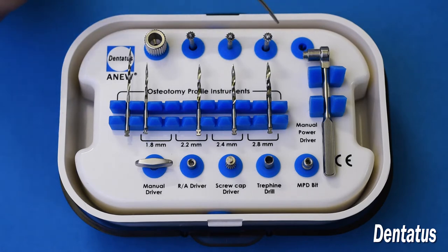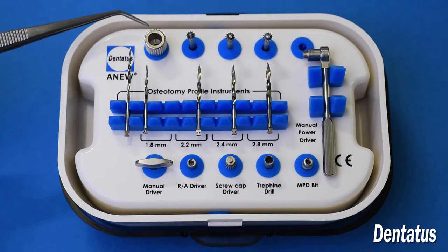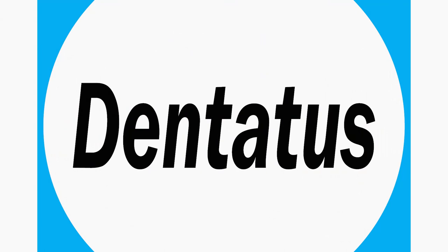Up at the top here you have your prosthetic instrumentation for overdenture preparation. There's the half round burr, which is used to make the undercut, your grooved burr, and your round burr. And this here is your ellipse driver, which is used to adjust the ellipse abutment for overdentures. So here we go. Let's begin.